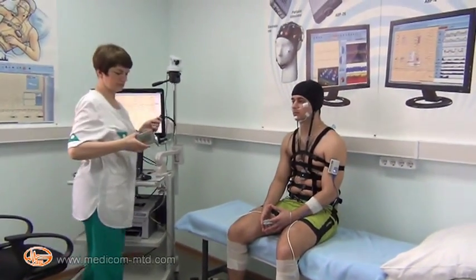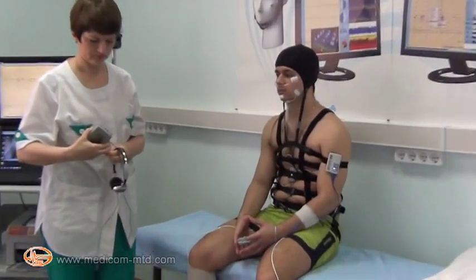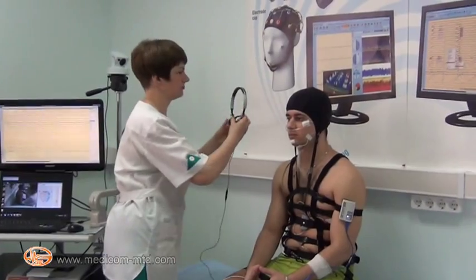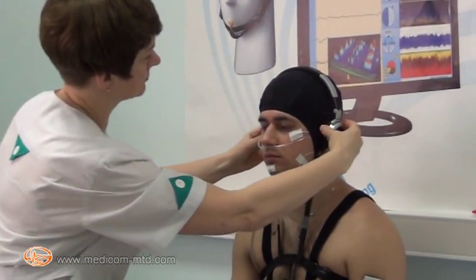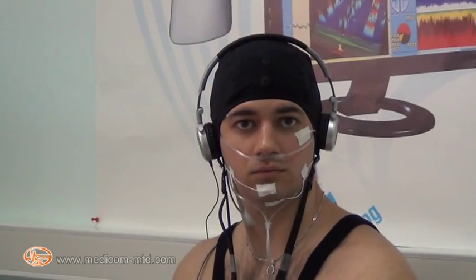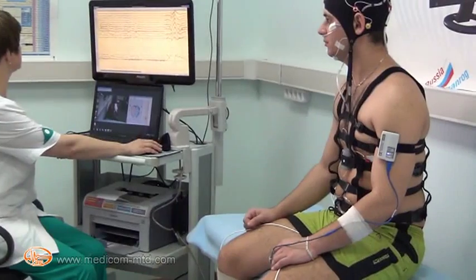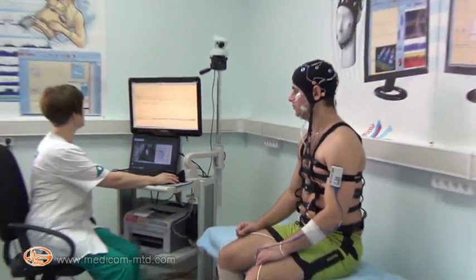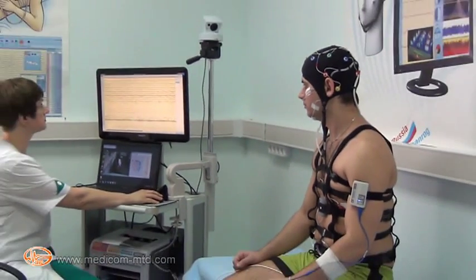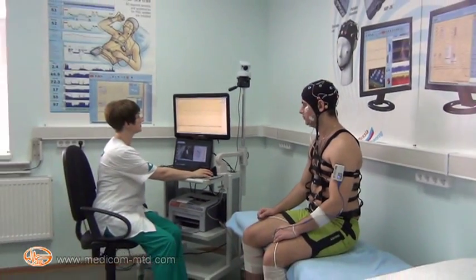Headphones are connected to the stimulator for phonostimulation, placed on the patient's head, and phonostimulation is carried out according to the scenario. For the functional test with hyperventilation, deep breathing is performed for 3–5 minutes. The scenario in automatic or manual mode allows setting markers according to the timer: hyperventilation the first minute, the second minute, and so on.